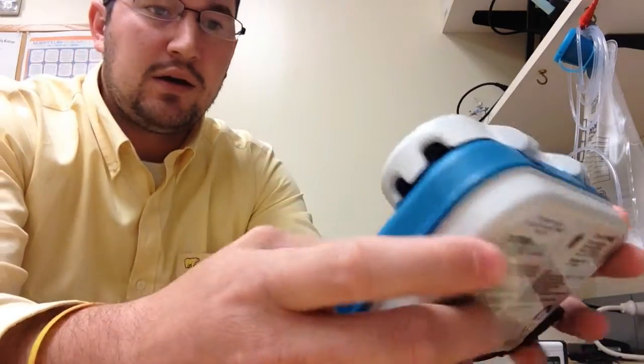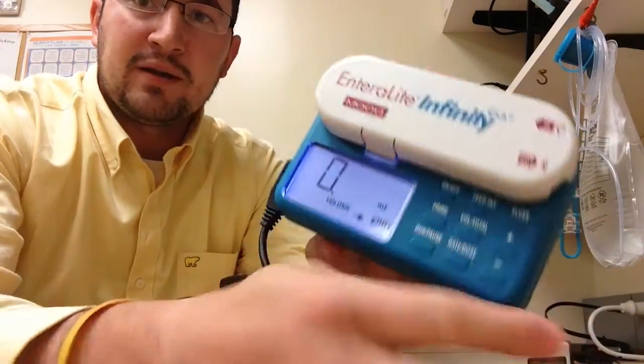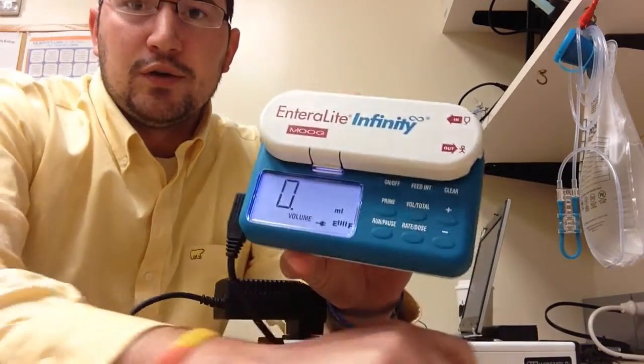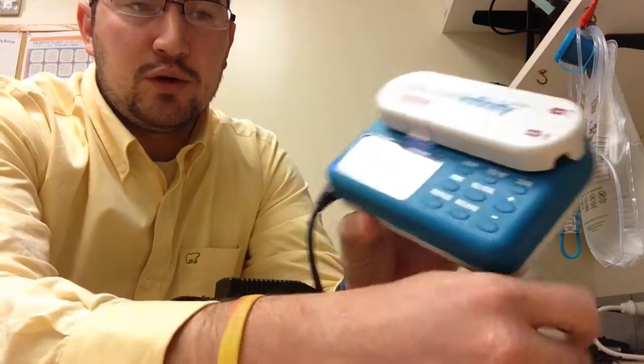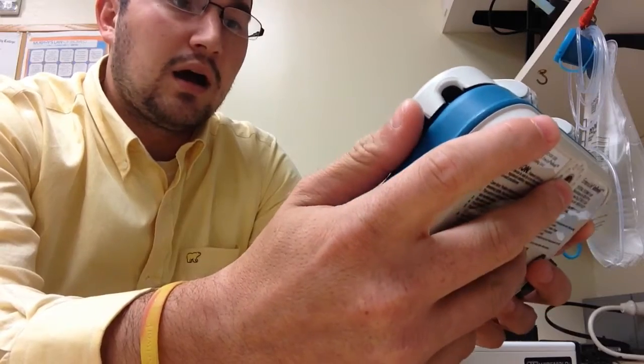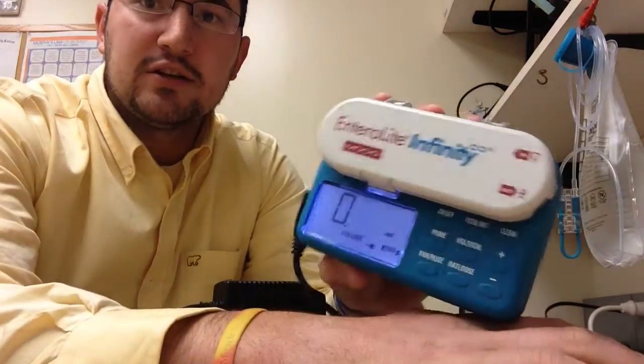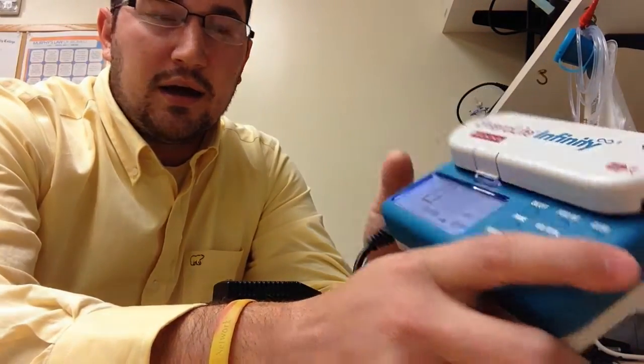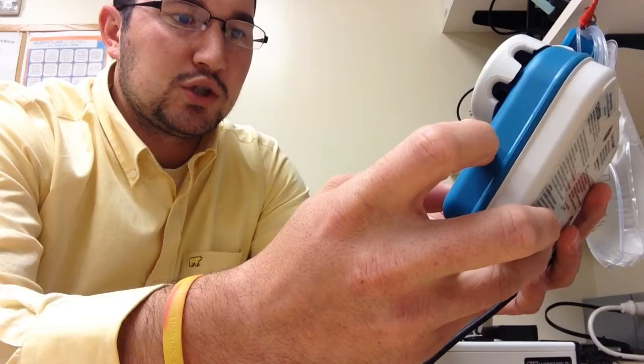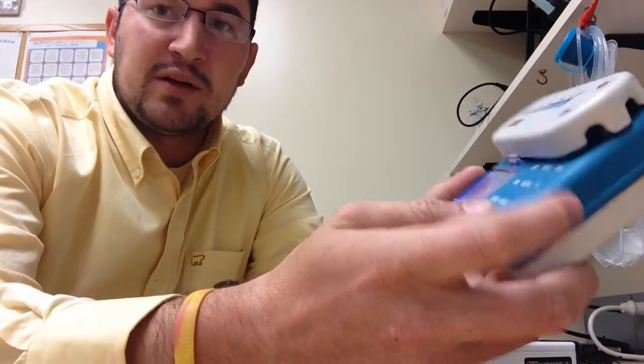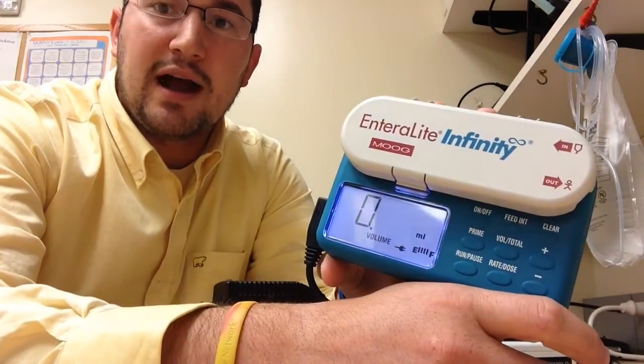So with programming the pump and running infusions, we do two infusions. One's 120 milliliters at 240 per hour, and the other one is 20 milliliters at 40 milliliters per hour.